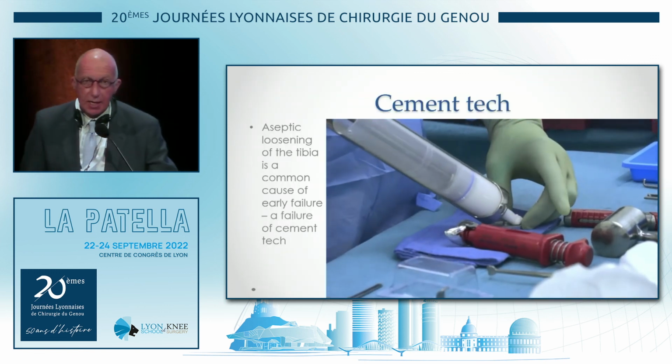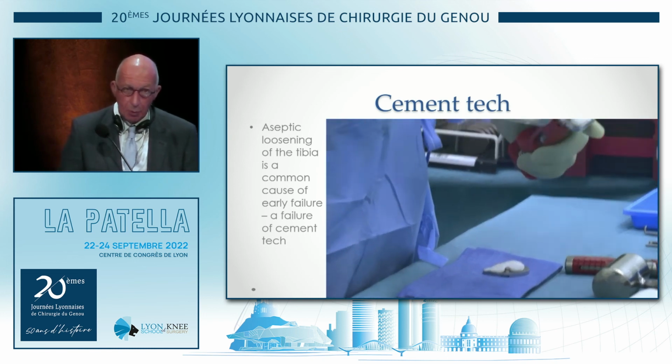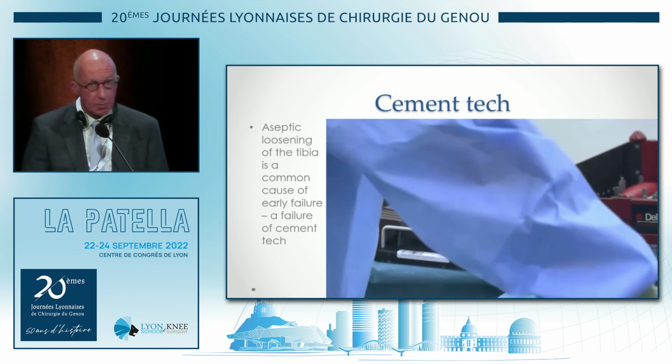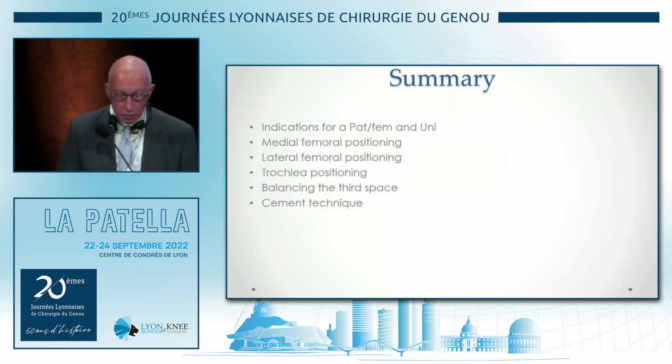And then finally, a cement technique, and we've heard about that just now. It's really, really important. And I always put the cement on the metal first and make sure we have a proper technique, just as we would carefully cement a total knee. Aseptic loosening is a common cause of failure.